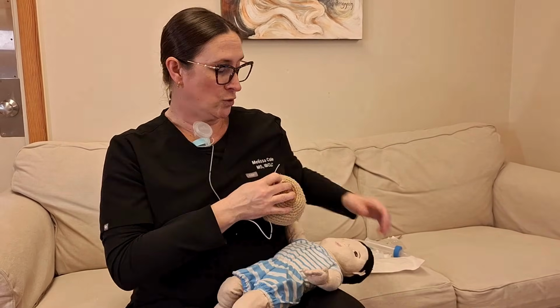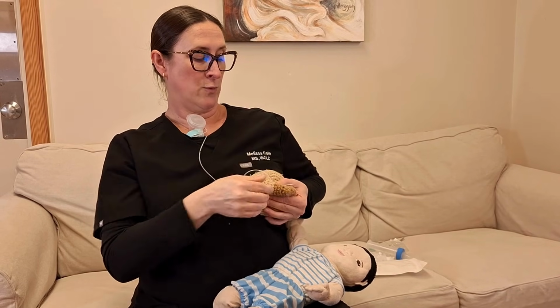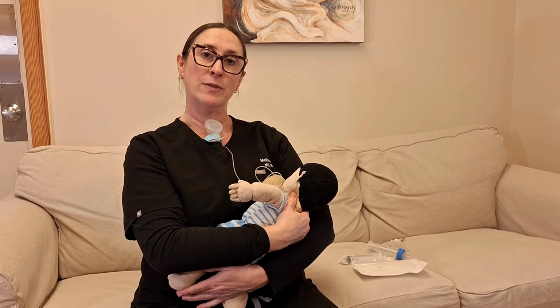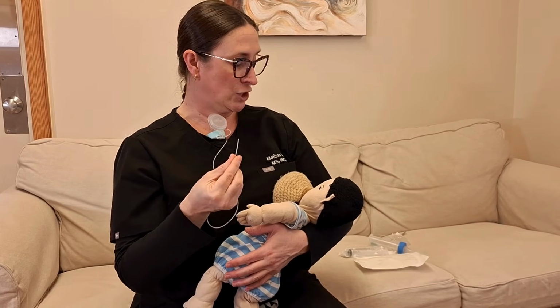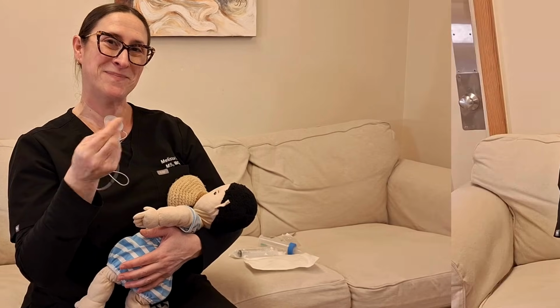Some people like to hold the tube to their chest in preparation for latch, so they'll hold it on there. They'll get their baby latched on, and then they can let go when they feel that the baby's securely on the chest, right? So it really depends on how your baby is latching, if they're needing supplementation, in terms of how often and when you're using this device.